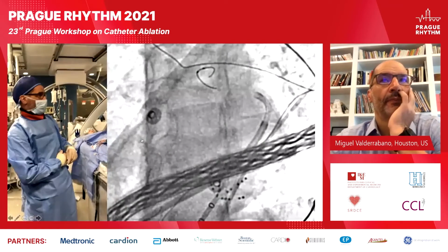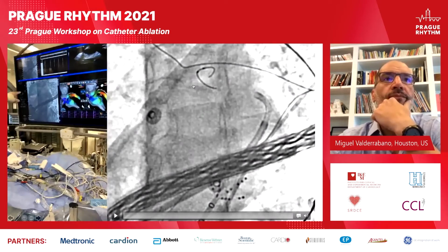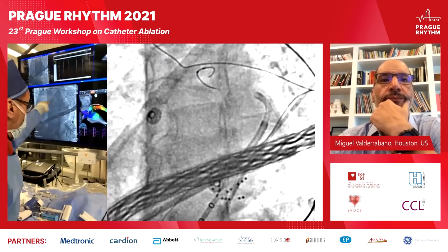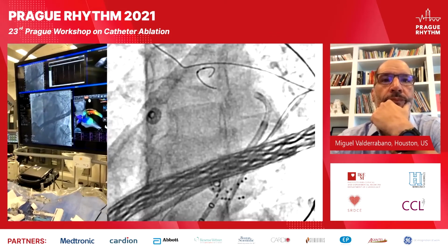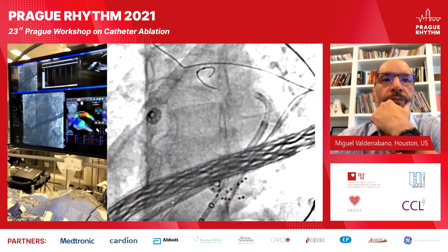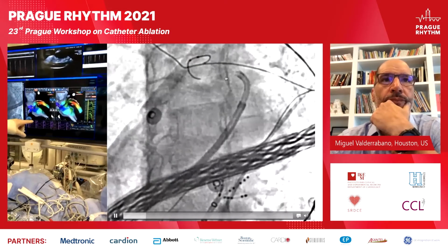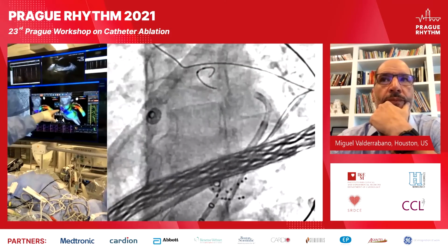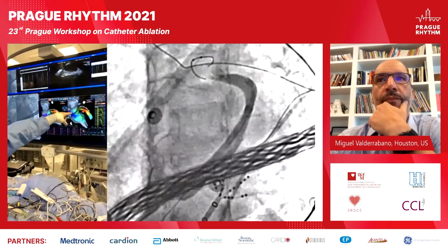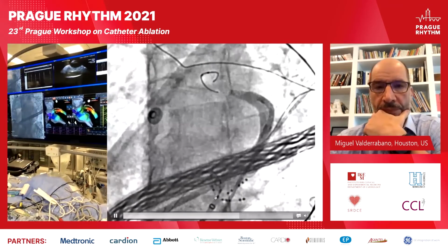All right, so we have come out of that initial branch. We got back in the main branch of this septal annular vein, and we're sampling from the distal part of the wire. Pacing there is giving us a 98.5 or 99% pace map. On Carto, you can see how it's right underneath the earliest signal that we had in the AIV. That's a more suitable target.